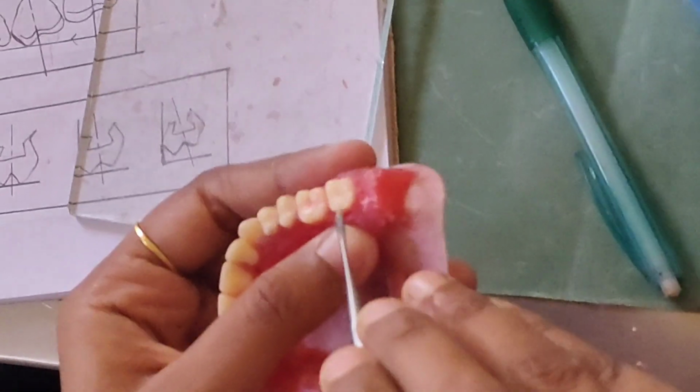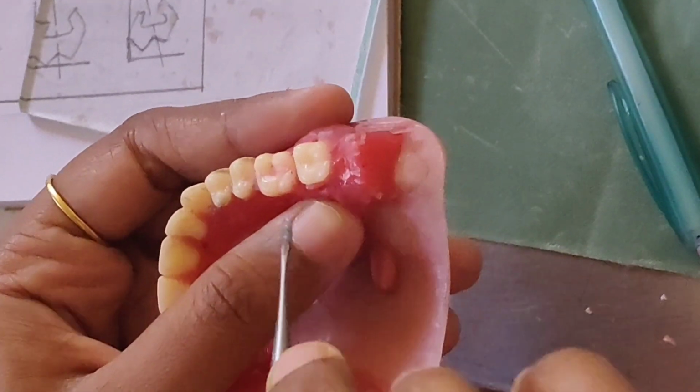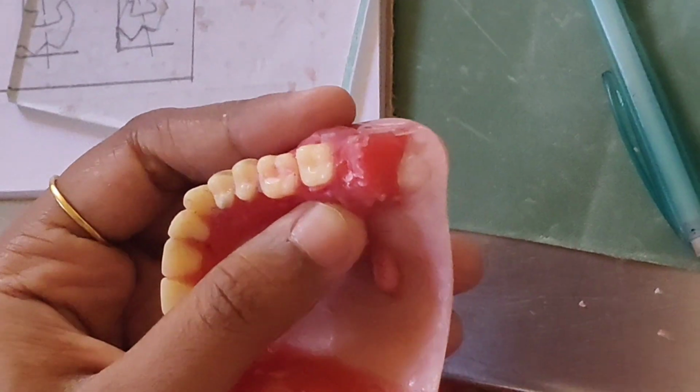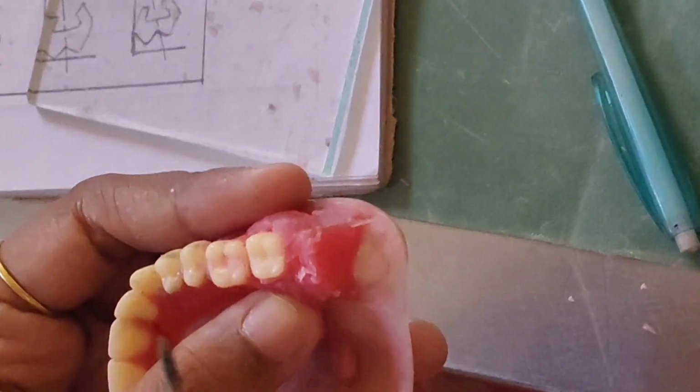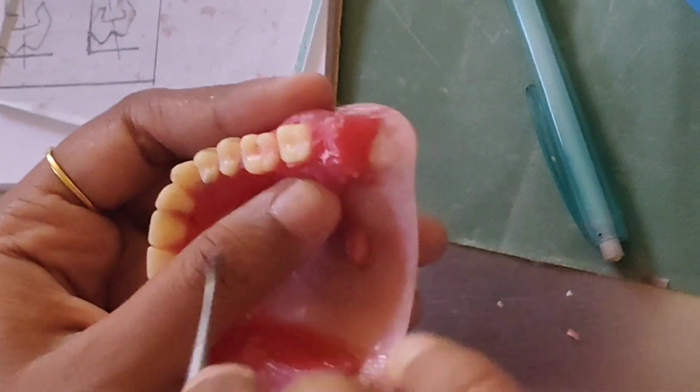This is in the same plane, so this cusp I want to raise. Only this cusp will be a little ahead, but it will not touch the glass plate, it will be a little above. So this part you have to just put here and raise it like this and check.